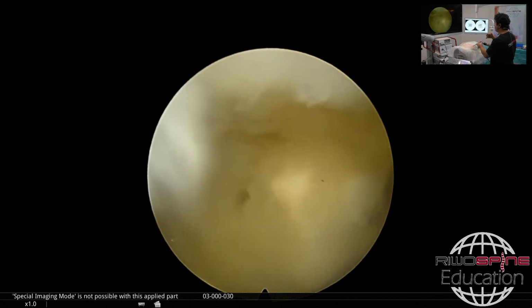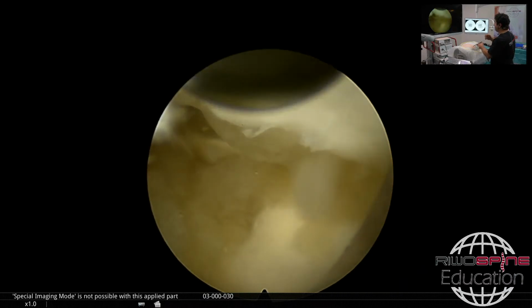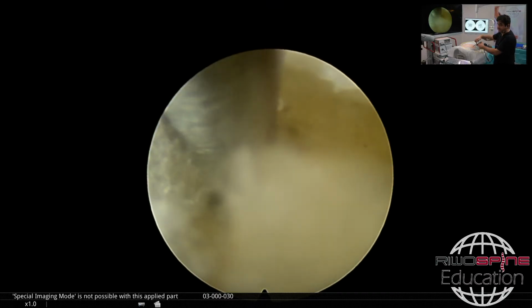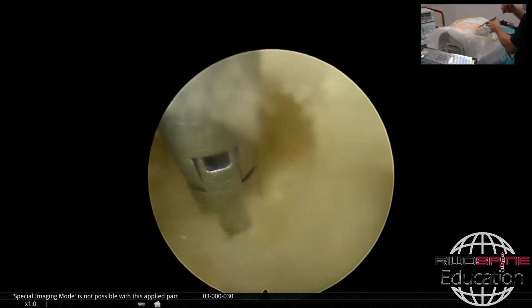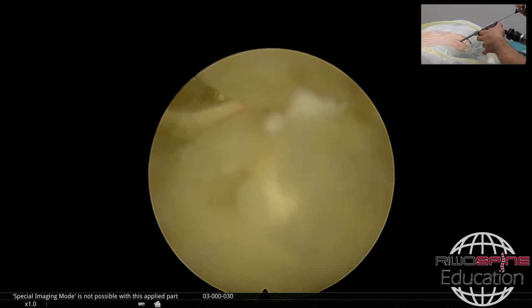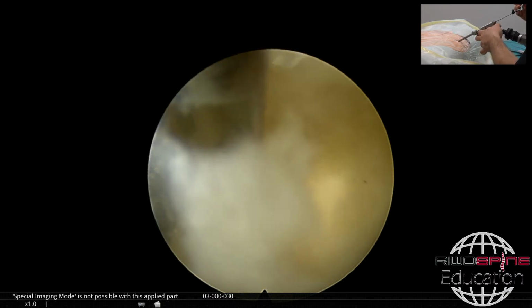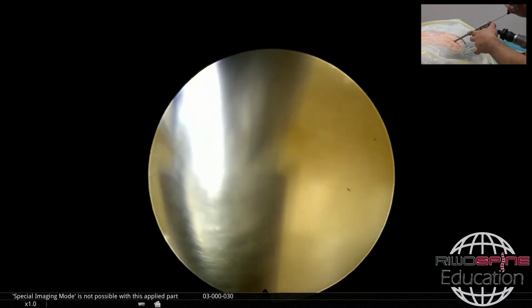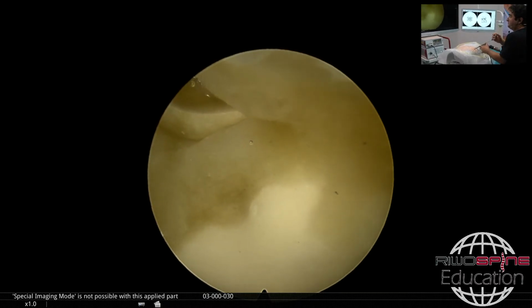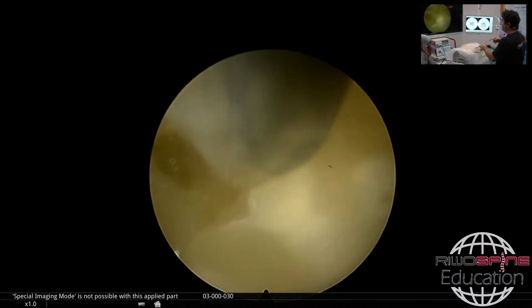Given the case where you are outside of the foramen, like I'm outside right now, do you hold the sleeve, or is your assistant holding it so you can focus a little bit? I always control the sleeve with my finger. So it's yourself, you don't ask your assistant? Yeah, always the question is coming, can we ask the assistants to do that? Of course, it is possible, but in this case, your assistant has to be very experienced with the full endoscopic technique just to do the maneuvers for you, in my opinion, to prevent some damage. It's not very easy to find this kind of assistance.